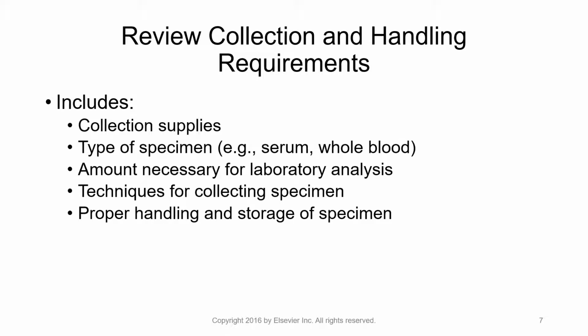That includes knowing what type of specimen you need. You choose the type of blood specimen collected based on which tests are ordered. You have clotting tests that are ordered, blood counts, metabolic panels, thyroid panels, a number of different tests, and different blood specimens are required for those. For example, we would need serum if we were going to test the thyroid level, thyroid stimulating hormone, or, like I've been saying, a metabolic panel. It's all done on serum, so you need to know the type of specimen you're supposed to collect.